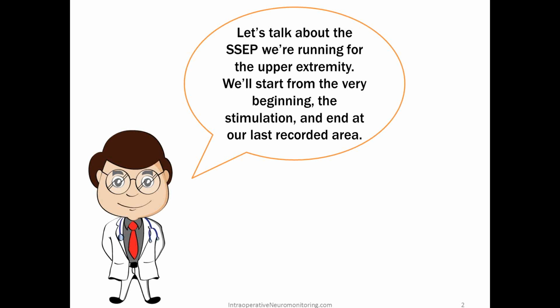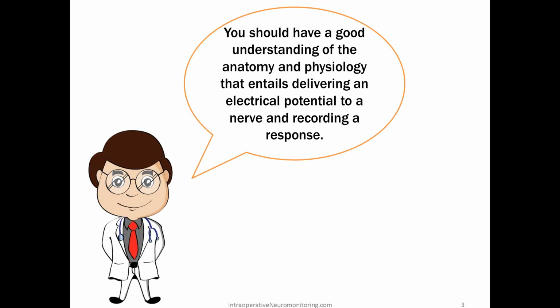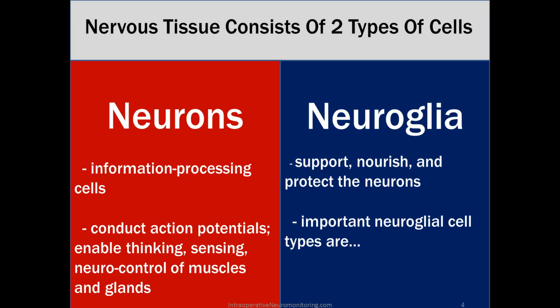So on the CNIM, SSEPs make up a large portion of the test. It's the modality that we probably use most across the country, and so it's something you're going to be heavily tested on. You should have a good understanding of the anatomy and physiology that entails delivering an electrical potential to the nerve and recording a response.